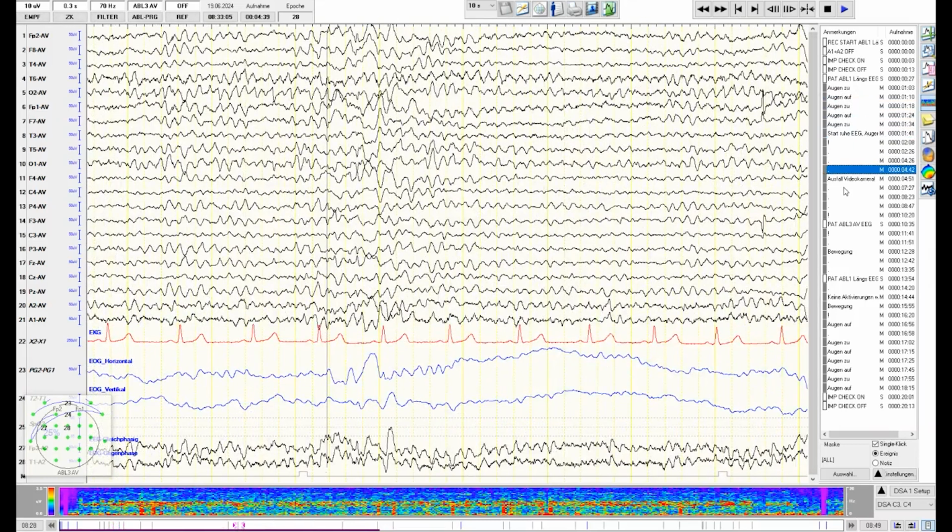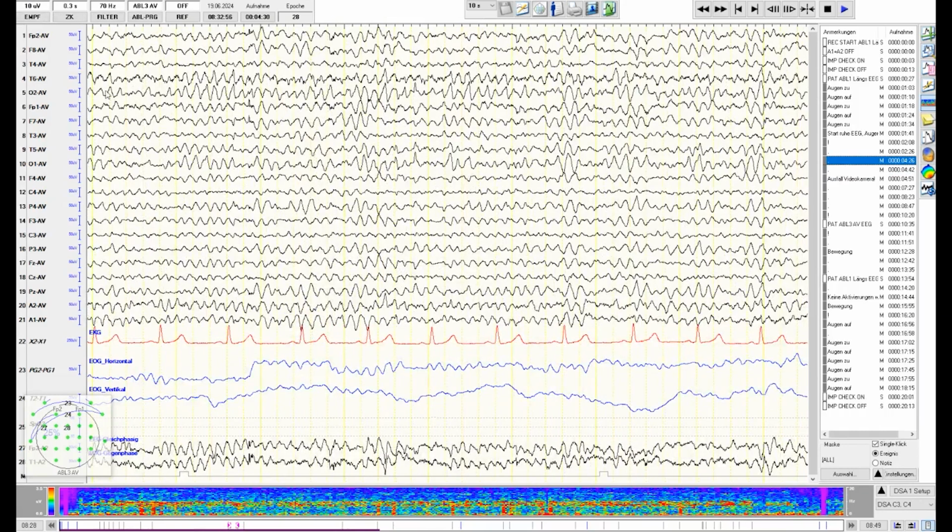Here and there, what we see is not a real ETP, but a highly irregular activity, which is called paroxysmal activity. Just for you to compare, here you see a basic rhythm which is quite regular, and nothing is very out of the row.